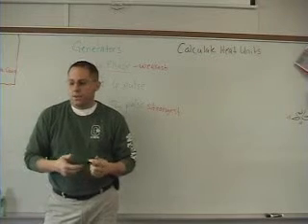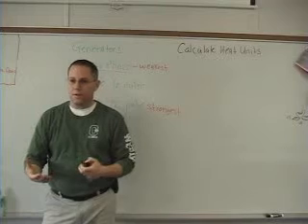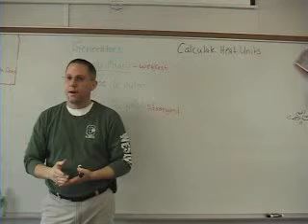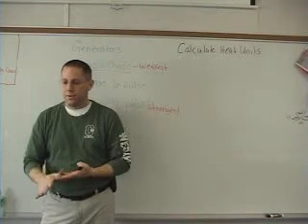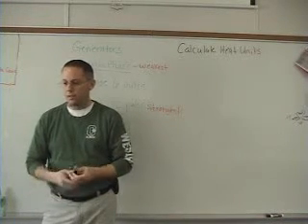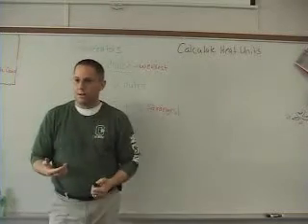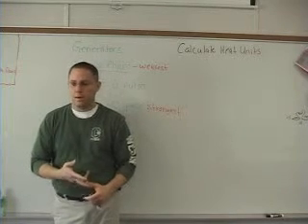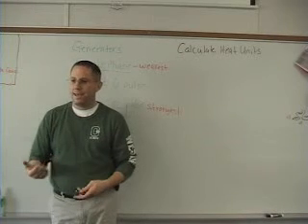So it's important to know how hot your X-ray machine is getting when you take X-rays. For certain X-rays, you can't just do one really quick right after the other, because you need to give the X-ray machine time to cool down. So what you have to know is how much heat you are producing. It's called calculating heat units, and it's actually pretty easy. Remember the 3 numbers that you put into the machine for the X-ray: your mA, your kVp, and your time. All you have to do is multiply those 3 numbers together, and that tells you the heat units.